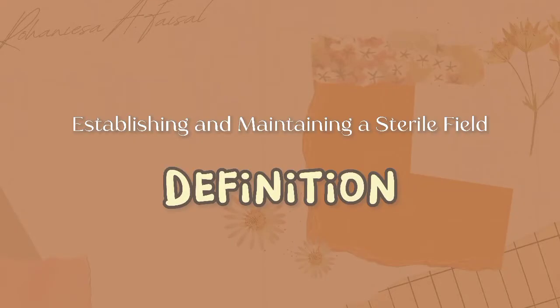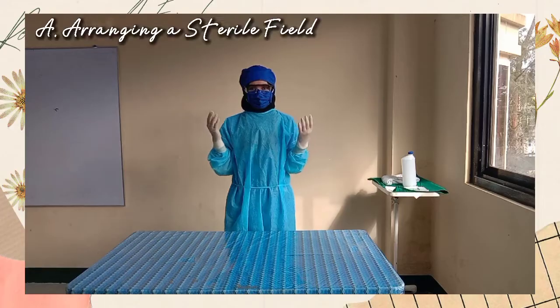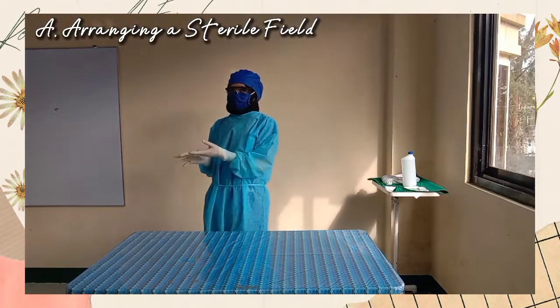A sterile technique has a set of specific practices and procedures performed to make equipment and areas free from all microorganisms and to maintain that sterility. It is often established by using the innermost side of a sterile wrapper or by using a wrapped sterile drape. Its purpose is to ensure the sterile items remain sterile and to protect patients from possible infection when normal body defenses are not intact. Wash hands to prevent transfer of microorganisms.